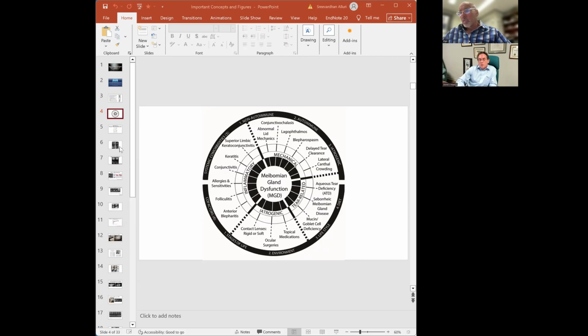I developed a prototype probe. The first patient had tried everything, had been everywhere. He agreed to let me insert the probe through the natural orifice of the gland. And what I found was, rather than thick meibum, I found fixed resistance. This was a completely new concept. No one talked about fixed resistance inside of a gland in the mid 2000s. As I passed the wire probe into the gland, it would not progress. I would have to give extra energy, and when I did, there was a discernible pop, and oil flowed. The meibum flowed along the wire probe, exiting the orifice.